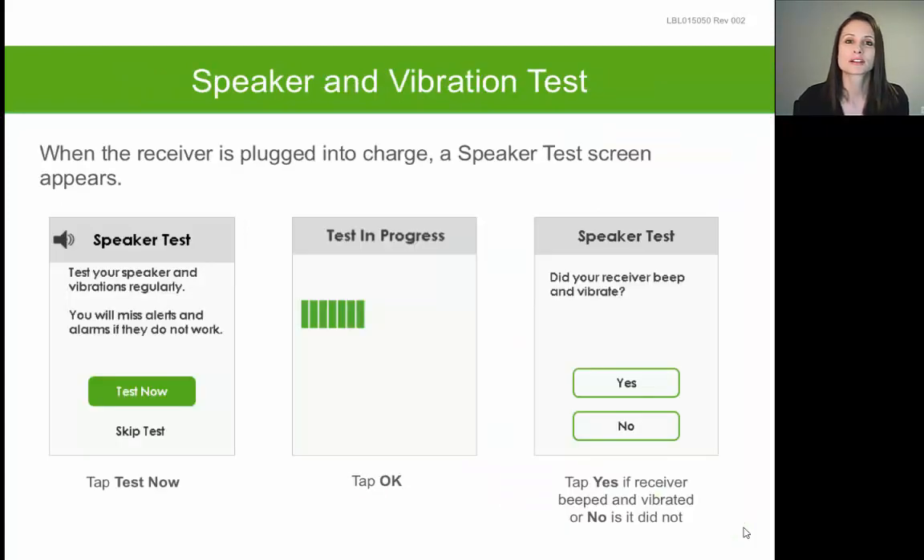Your receiver needs to be periodically recharged approximately every one to two days. You can recharge it using the USB charging cable and power adapter that came with your system. Every time you charge your receiver, you will get a speaker test prompt asking if you want to test your speakers. Tap Test Now and make sure you hear an audible alert and feel a vibration. If you do not hear an audible alert, tap No and contact technical support.